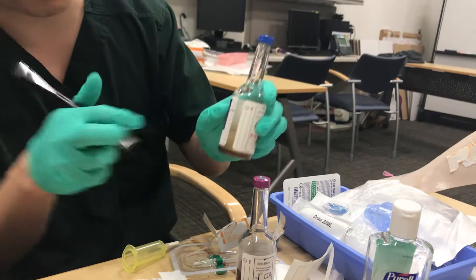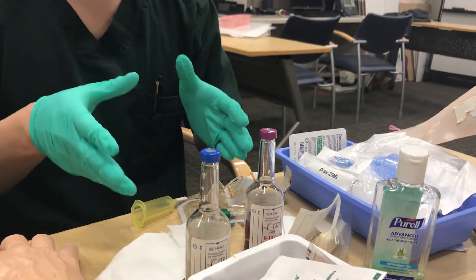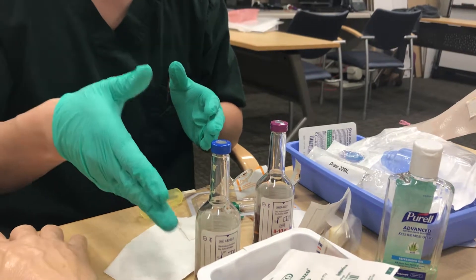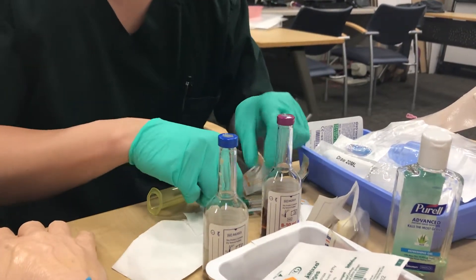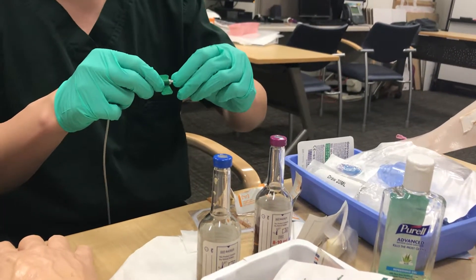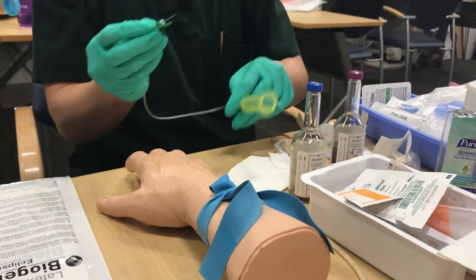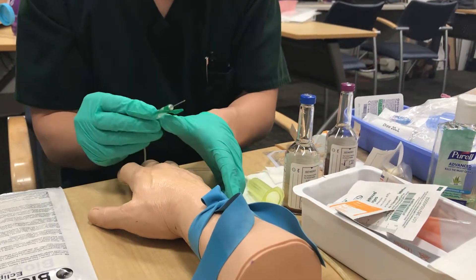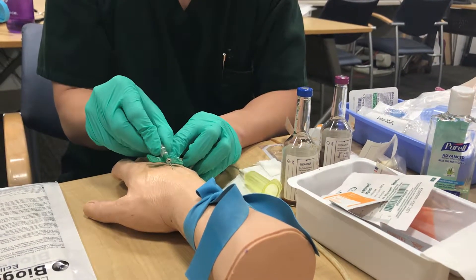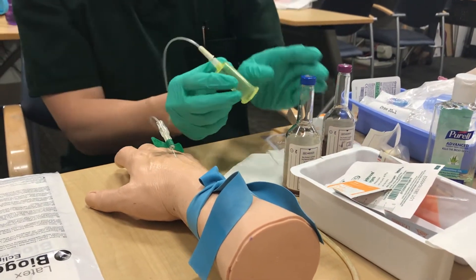Ideally you want to grab 20 milliliters minimum total for both bottles, but if you have to choose, always put more in the aerobic than the anaerobic — at least five cc's for aerobic and five cc's for anaerobic as a minimum. To perform the stick, flick off the needle tip, retract the skin, and go ahead and poke.